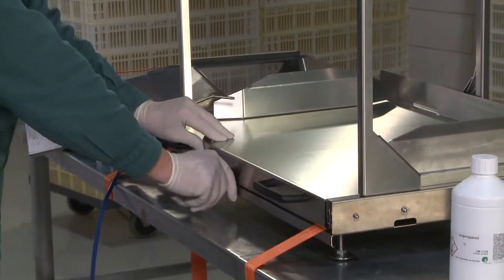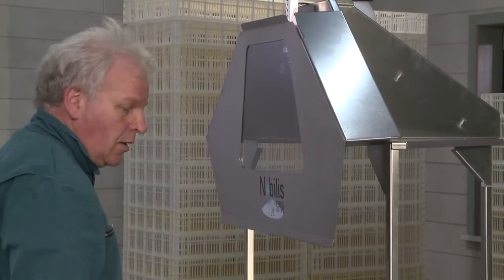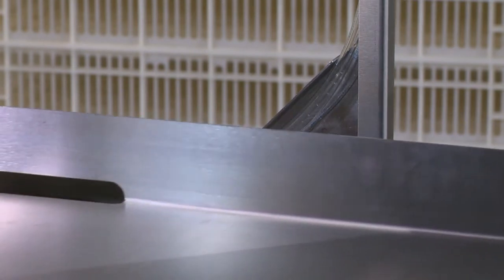In case a tube has been damaged or needs to be replaced, make sure to use the correct replacement part. There are different tubes for air and liquids. A complete list of spare parts is in the user manual and available online.